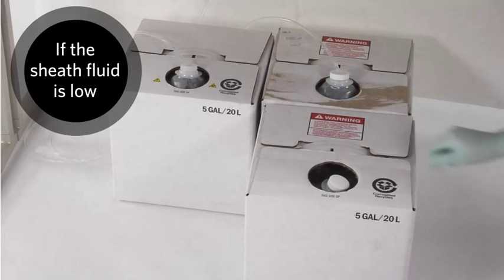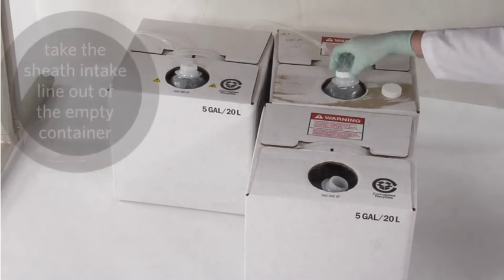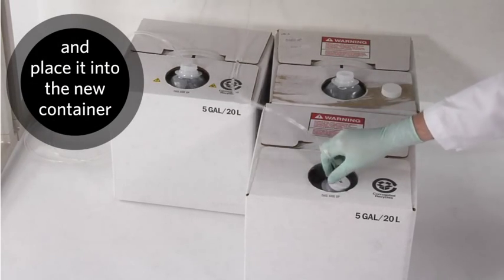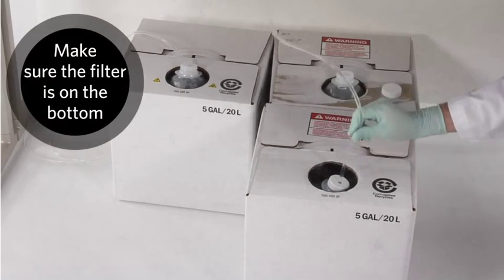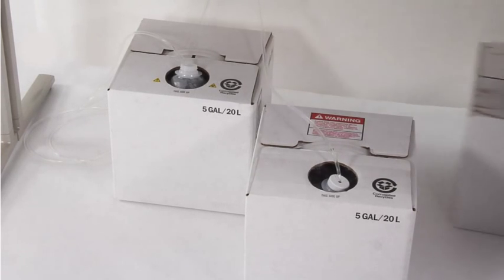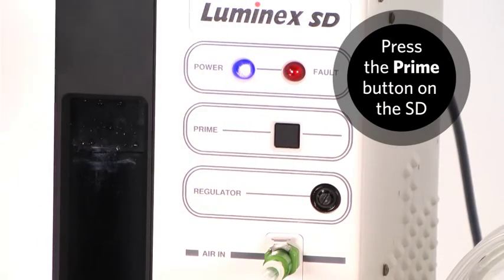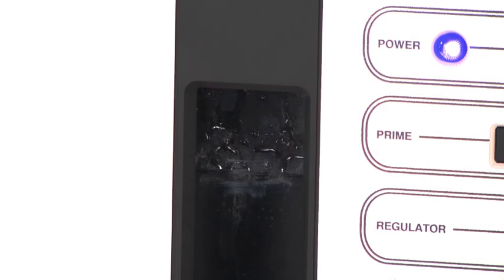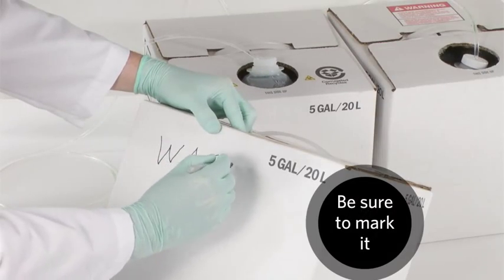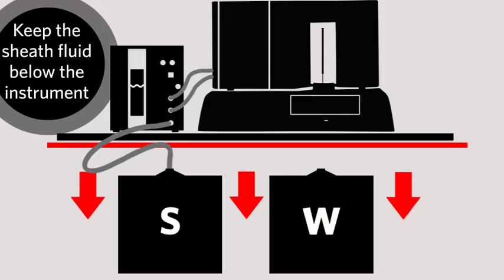If the sheath fluid is low and a disposable 20L sheath fluid container is being used, take the end of the sheath intake line out of the empty container and place it into the new container of sheath fluid. Ensure the filter at the end of the intake line is lying on the bottom of the container. Next, press the Prime button on the front of the Luminex SD. The empty container can now be used as a waste fluid container. Make sure you mark the container so it doesn't get confused as sheath fluid when it is full. Also, be sure to keep the sheath fluid container below the Luminex 200 and SD.